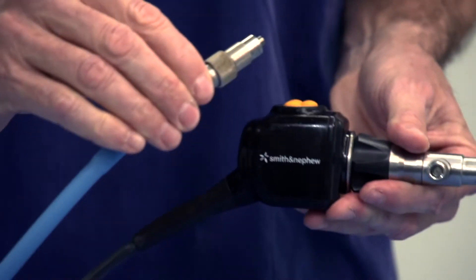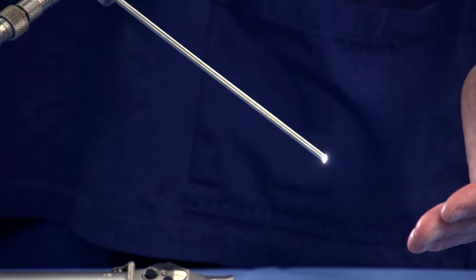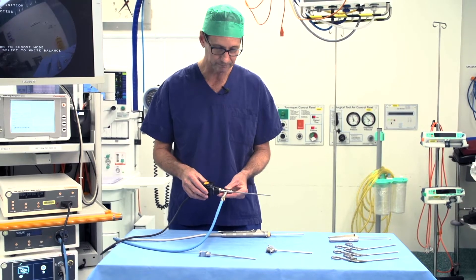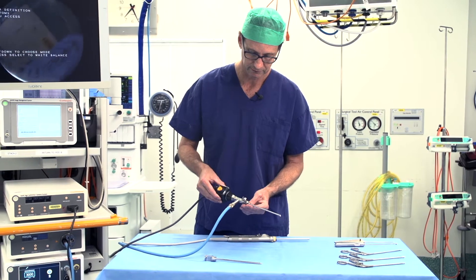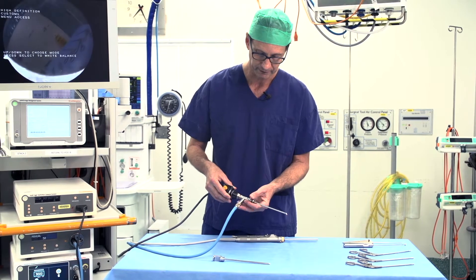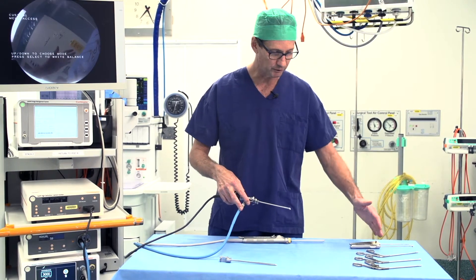Our camera needs a light source. So we have our arthroscope, light source, and camera inserted into the joint, with fluid coming in. Then we make a second incision to do the actual operation.